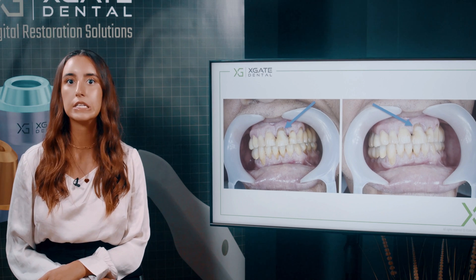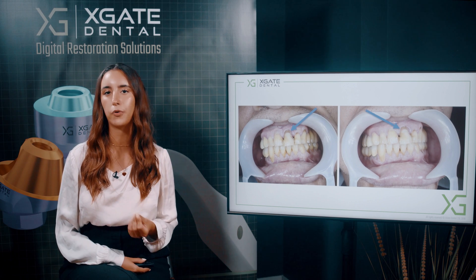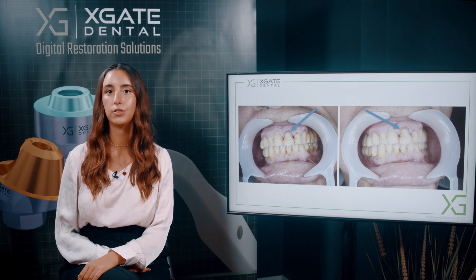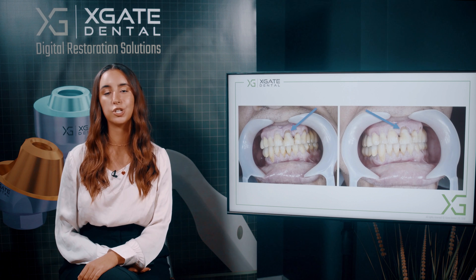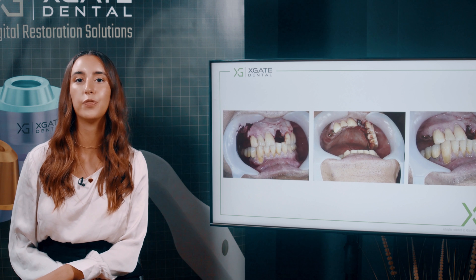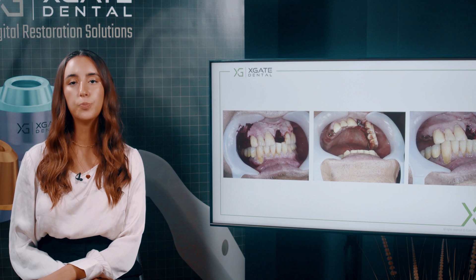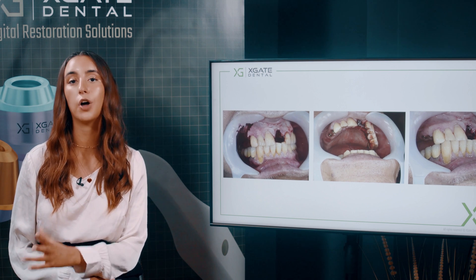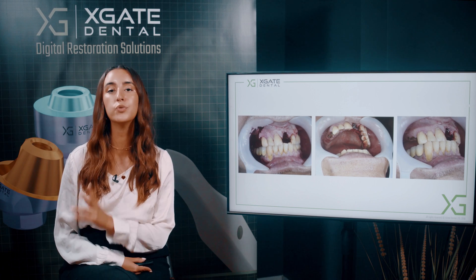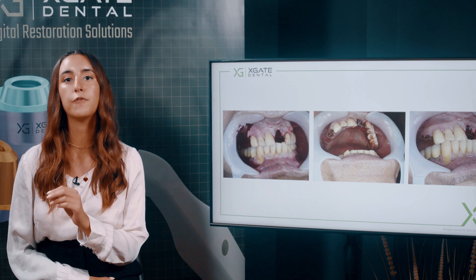In this case we want to extract tooth number 21. Of course it's an aesthetic problem when you extract this frontal tooth and you need to have an immediate solution for temporary restoration. In many cases you take impressions before the extraction and make a Maryland bridge. What we did here was take an impression on those implants and make a Maryland bridge to restore tooth 21. The bridge was based on multi-units — we took impressions on those multi-units and made a screw-retained Maryland bridge.